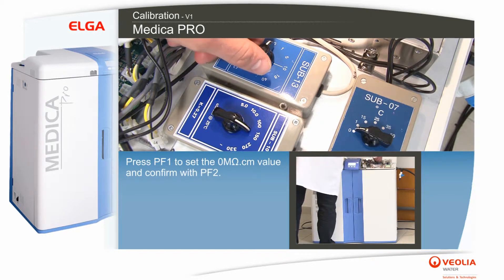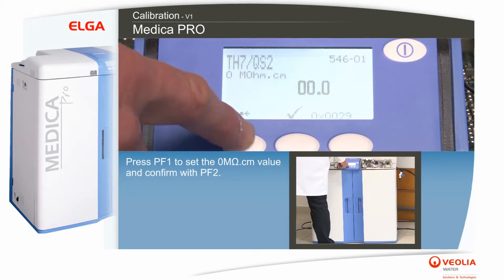Press PF1 to set the 0 megohm centimeter value and confirm with PF2.